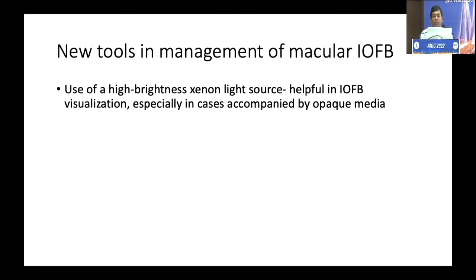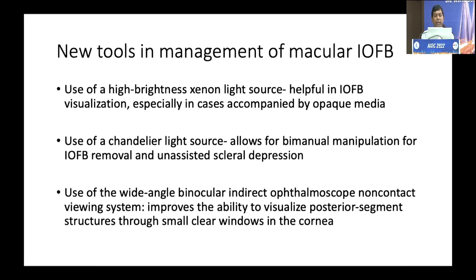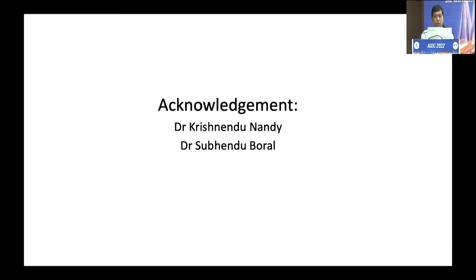So the new tools in the management of macular foreign body, what we have now, are a high brightness xenon light source, chandelier light source, so that you can use both your hands, and a wide angle binocular indirect ophthalmoscope. A non-contact viewing system, BIOM, helps in having increased vision.